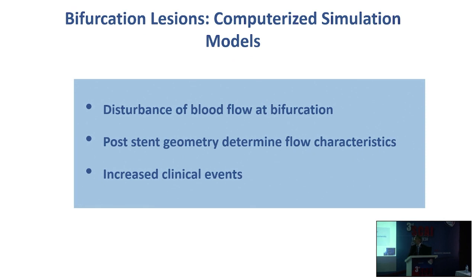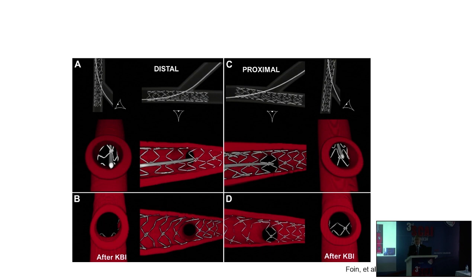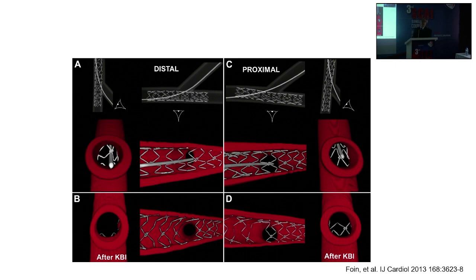So I will close this. This is what we talk about, wiring the distal one. You have to try to do that, but there is no way that you will know for sure that you did. You have to apply the appropriate technique to do it, but there is not a chance on earth that you will say every time that you crossed in the distal one.